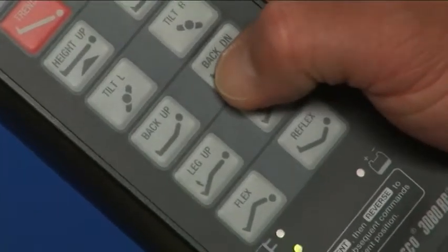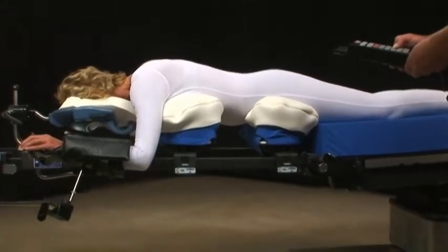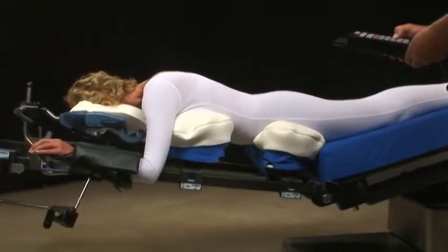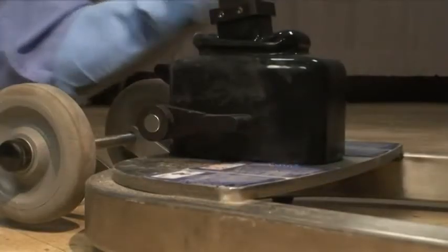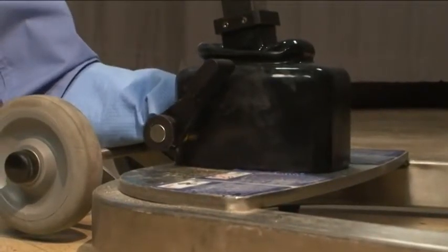Bringing the patient into lordosis or extreme lordosis will close the disc space. This position may be useful for fusions. If you do choose to lock the brake at the base of the frame, remember to unlock it when using intraoperative flex.